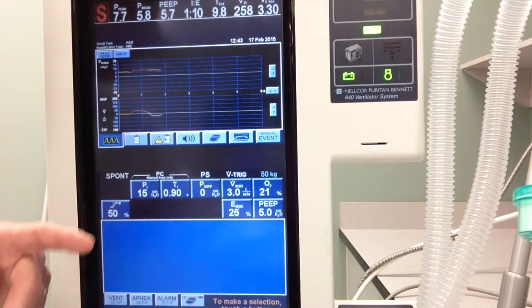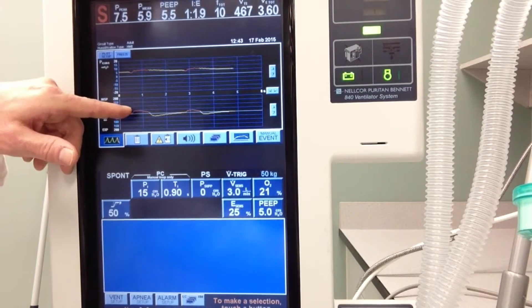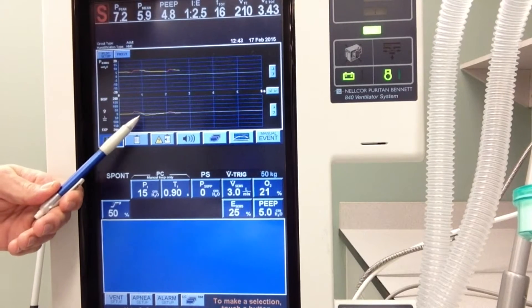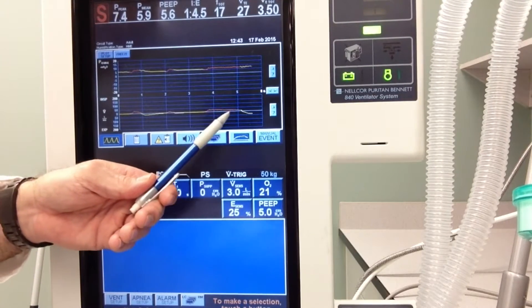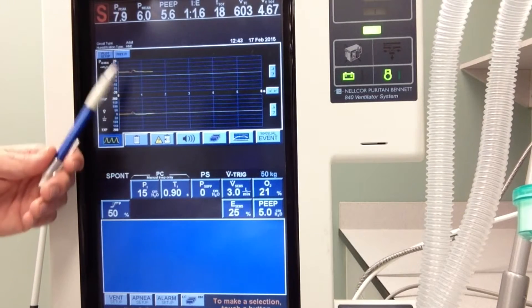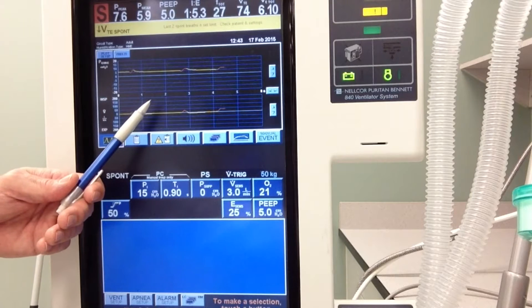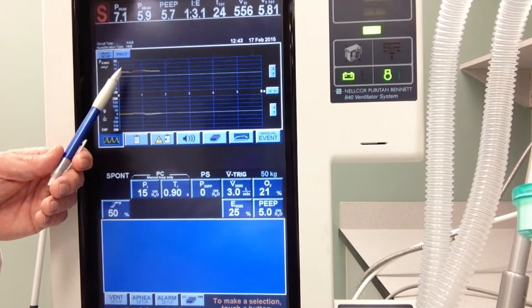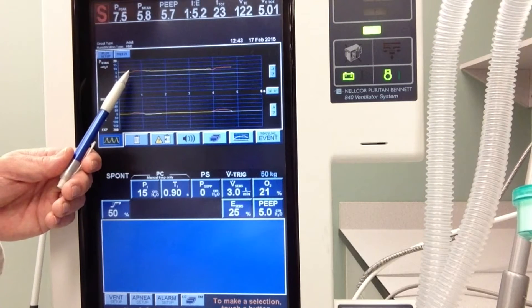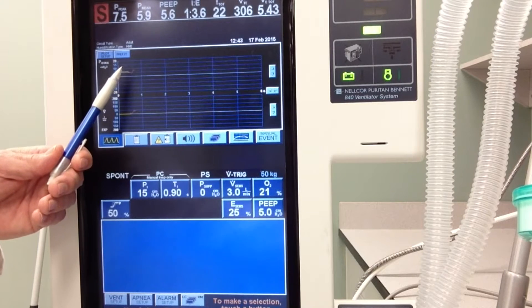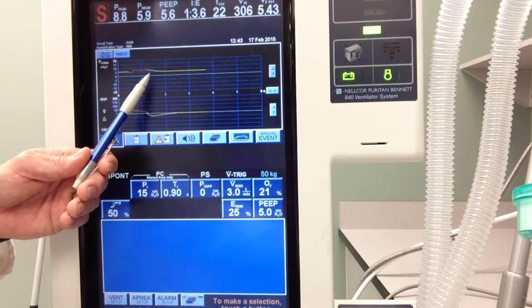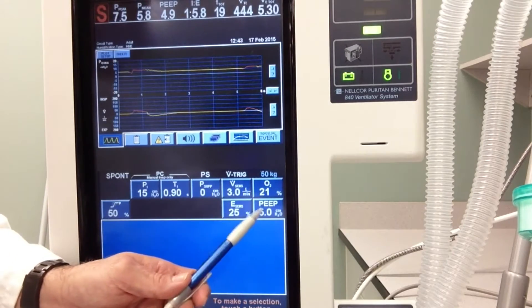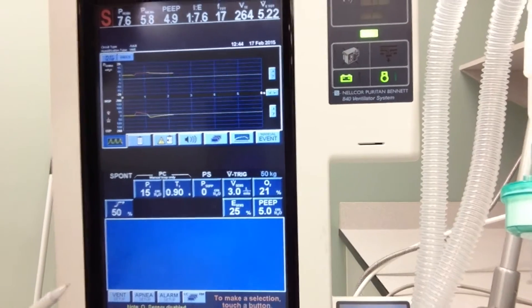As the patient is spontaneously breathing and triggering that spontaneous breath, we can see our inspiratory flows just right here. There's inspiration, then exhalation — here's a really long prolonged inspiration, a short inspiratory effort, and then a long inspiration again. On the pressure waveform, inspiration causes a little initial change in the pressure delivered to the patient, and then the pressure builds up a little as we exhale. So the ventilator is trying to maintain a constant pressure of plus five in the circuit — a CPAP pressure.